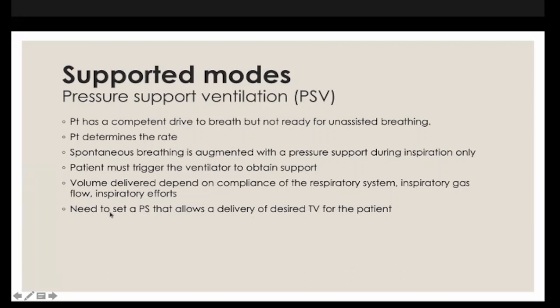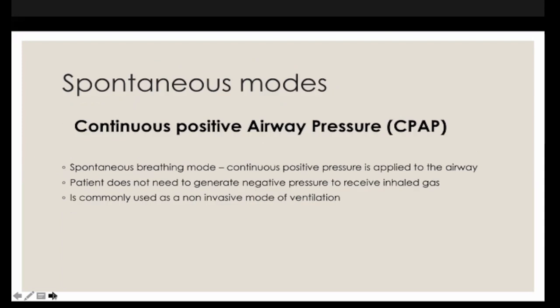And you have to sit there and actually see. You can't just set a pressure support and walk out, because you have to see how much tidal volume is being built up by this pressure support. So you have to stay with the ventilator, stay with the patient, and see how they build up the volume.